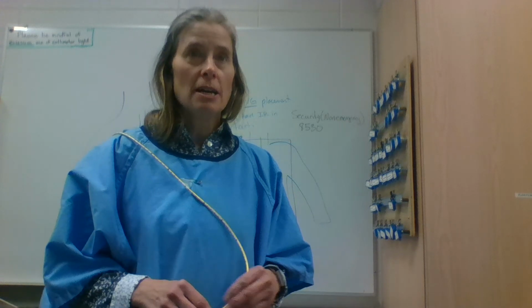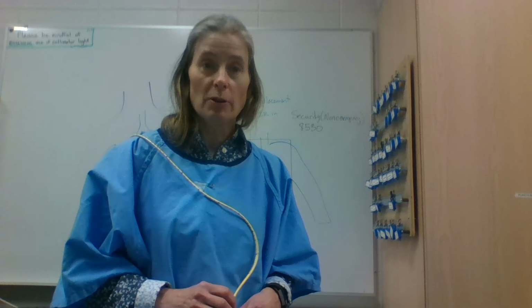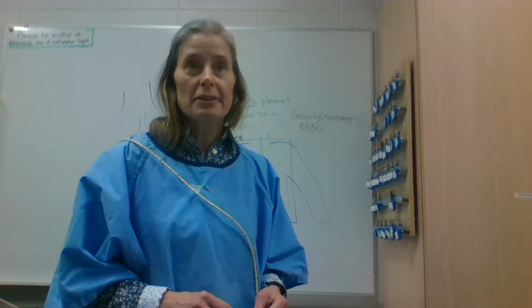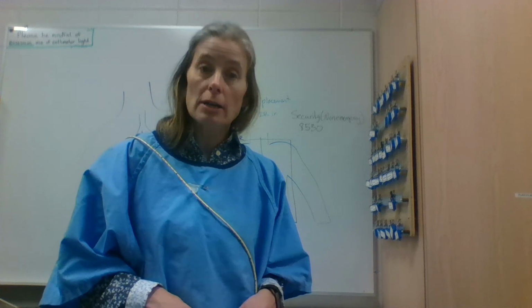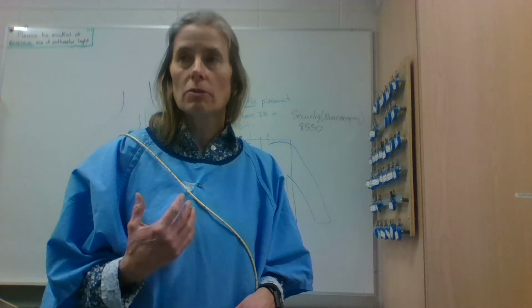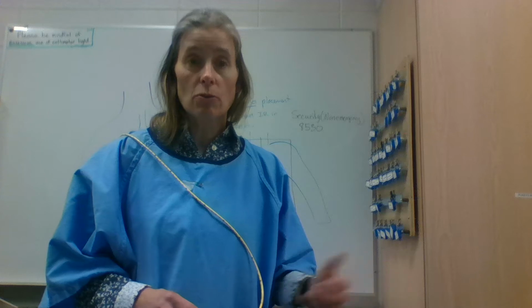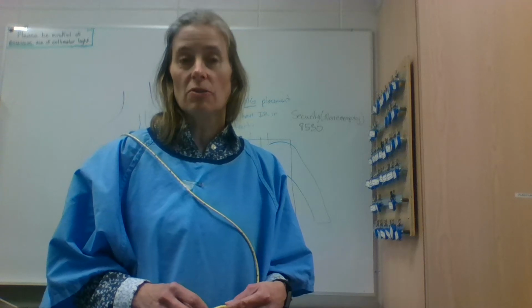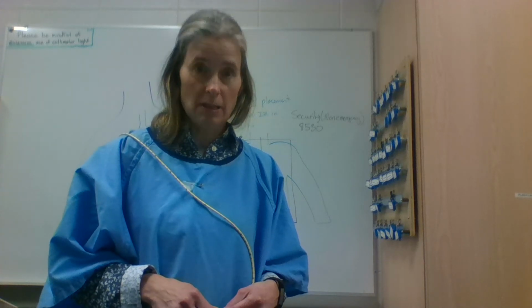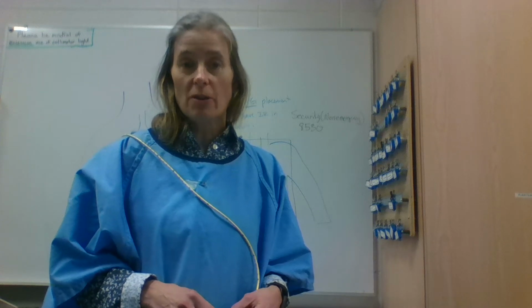So, for instance, if a patient had to have oral contrast for a CT scan, but they were nauseated or perhaps it's post-surgical through their esophagus or something, and they weren't able to take the contrast orally, then an NG tube would be inserted, and we could use that to get the contrast into the stomach, large bowel, small bowel, and that sort of thing.